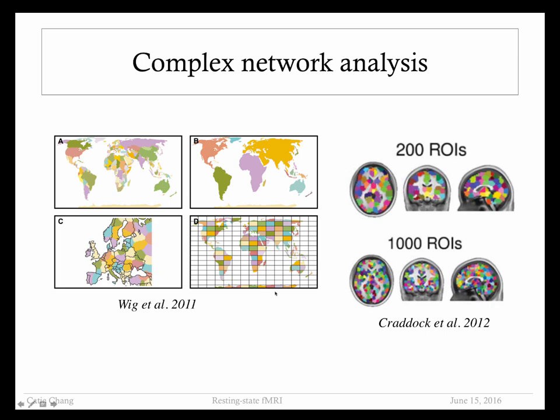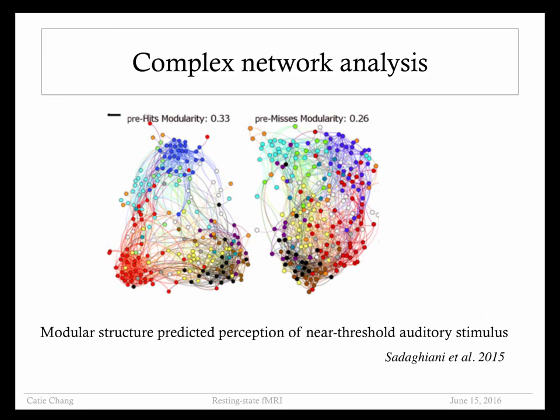If we randomly carve out nodes without really considering the underlying information or structure, then we might get unintended results because we'll be mixing inhomogeneous entities into one node. And there's been a growing subfield of fMRI methods that focuses on ways of parcellating this data into nodes.